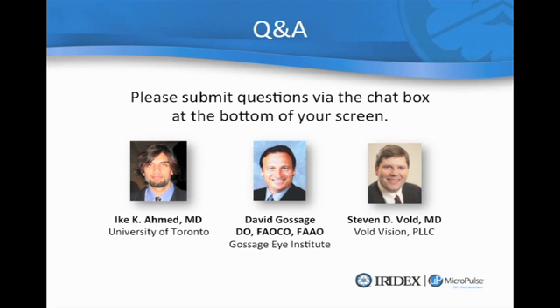From our standpoint, I'll sit down and I'll discuss with the patient their treatment options. Mention that, in the past we used to use medications quite frequently to lower intraocular pressure. Nowadays, we have the ability to use laser to help treat their pressure. A lot of people are starting to now opt, I think, for the laser treatment. I think they understand the fact that they're not having to use medications. They're already on so many different systemic medications, and they prefer not to have to add another medication. They understand that maybe the cost of the medication is pretty high too, and so from a compliance issue, they feel having the laser done, hopefully bring the pressure down, will be fine for them.